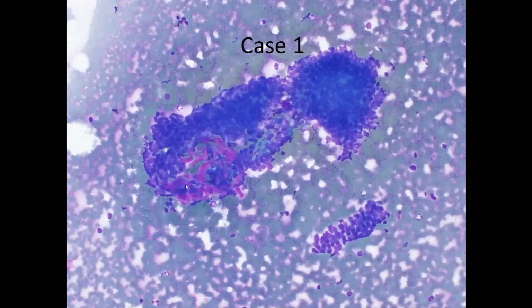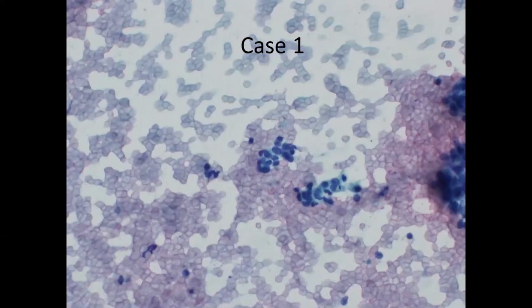You can see here that maybe there's a little bit of this hyaline stroma, but it's not making balls or anything like that, and there's not very much of it. Beyond that, you basically just have these clusters of basaloid cells. So it definitely looks to be cellular and to be a neoplasm, but beyond that, hard to say much aside from the bit of stromal material here. At higher power, we can appreciate that these basaloid cells in the Pap have very bland nuclei, very nondescript granular chromatin, and not a lot of pleomorphism. So we just signed this out as a basaloid neoplasm.